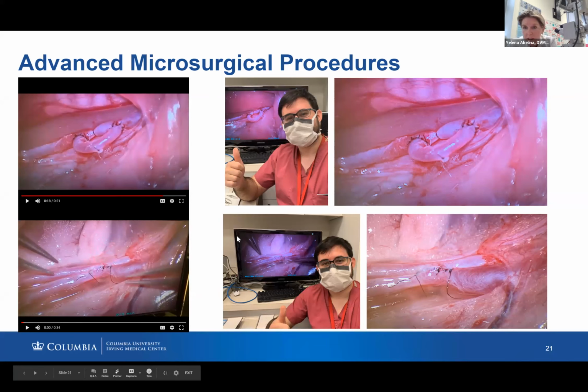This is actually basic, and going back to continuous suturing, this is the only way we use it because this is what they do clinically. Because the artery and the vein were right there on the rat model, this is why we used those vessels together. Usually they use two arteries together, but this was just done for practicing purposes.